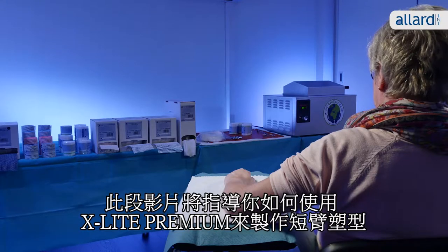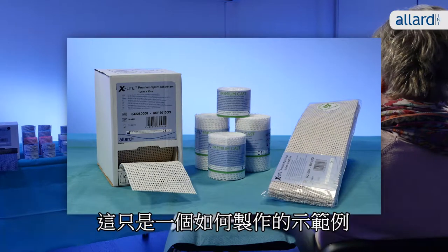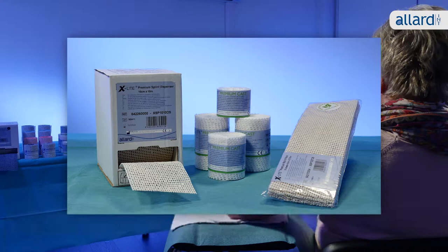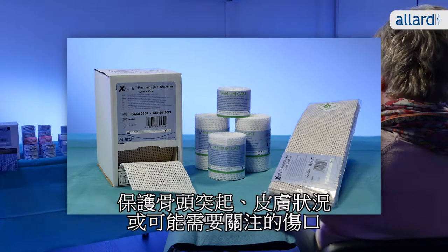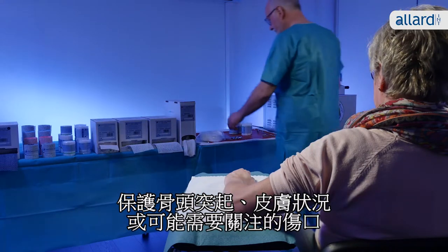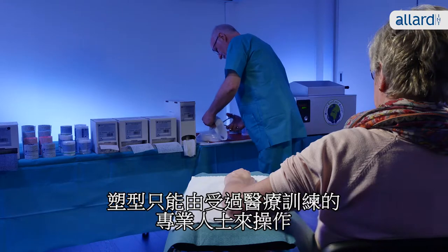This illustration will guide you through how to make a short arm cast in X-Lite premium. However, this is only an example of how to make the cast. Always make sure to evaluate the individual patient's need for support, protection of bony prominences, skin condition or wounds that might require extra attention. The cast should only be applied by professional medically trained persons.